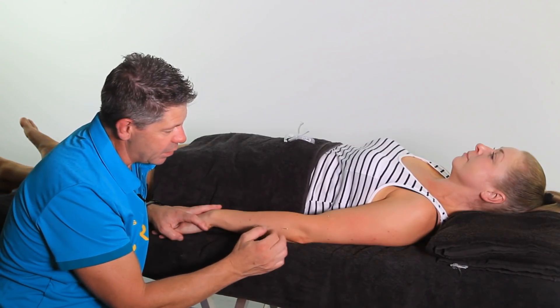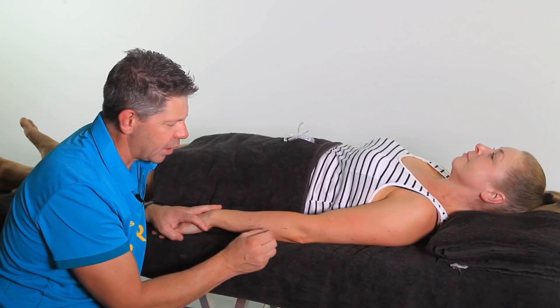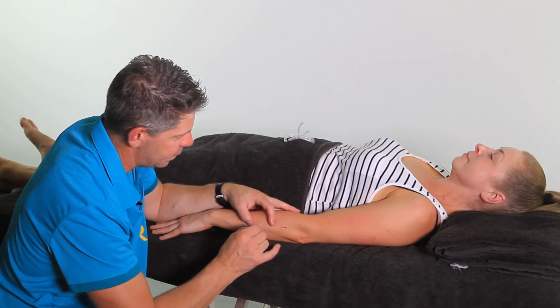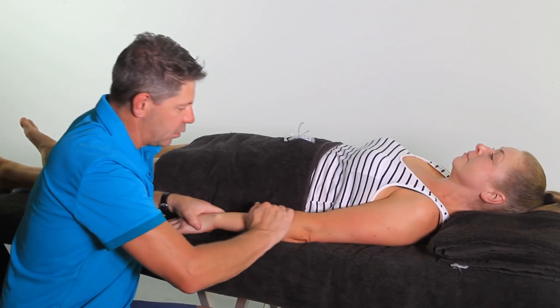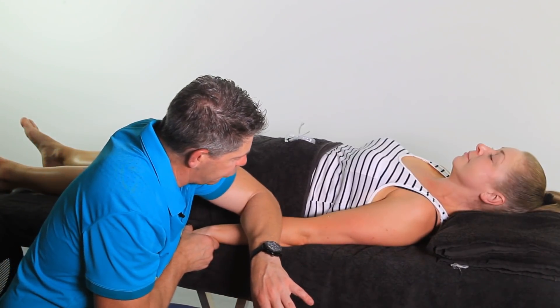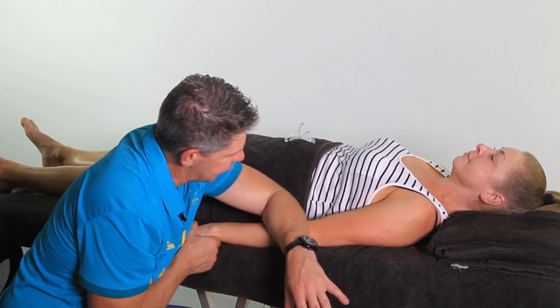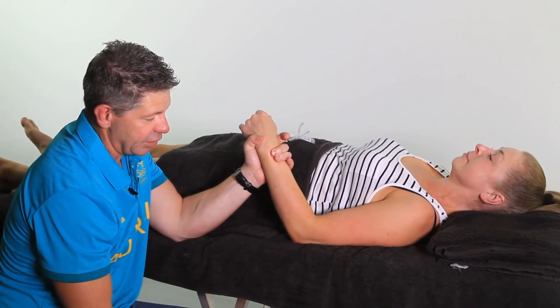Once the needles have been jiggered about and there's no more sensitivity, that tells us the needles have been in long enough. Simply take them out straight into the sharps container. Then always follow up with some soft tissue work — a little bit of wrist extension, bring over a broad forearm, and work through that extensor carpi ulnaris like so. That's dry needling for the extensor carpi ulnaris and associated other extensors as well.